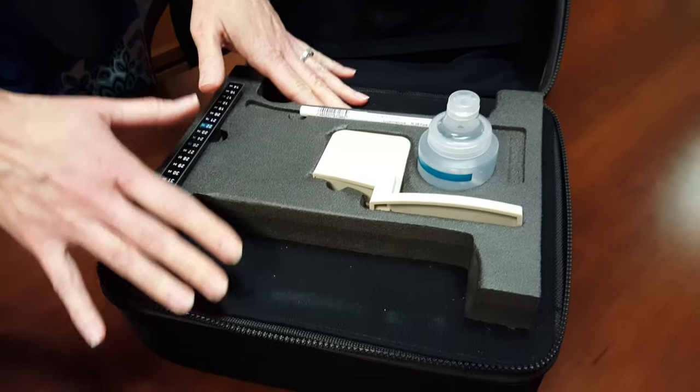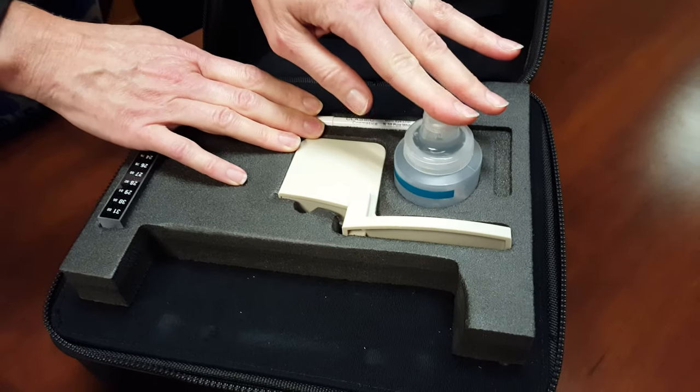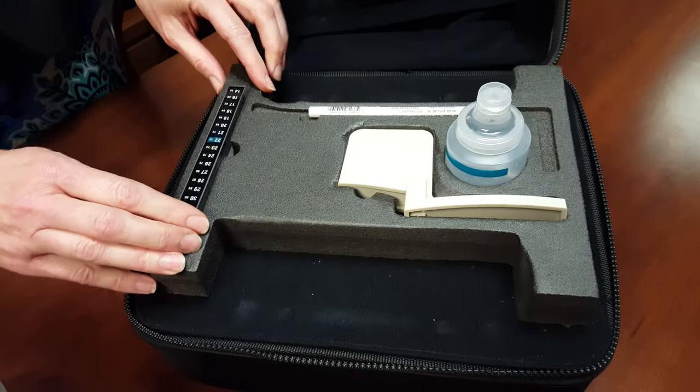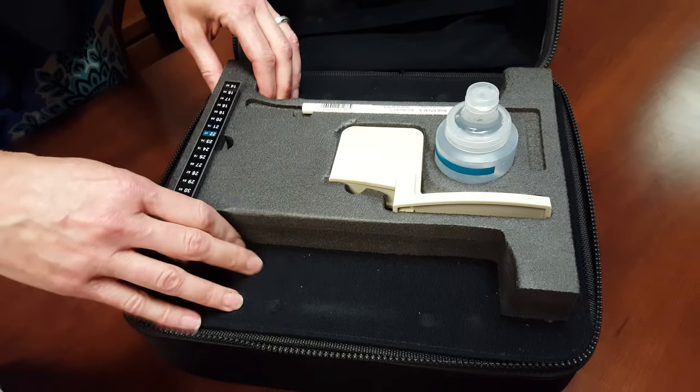There's a top layer and a bottom layer. On the top layer you will see your skin marker, your ultrasound gel, your measuring tape, and your phantom for quality verification piece. Just tuck that away in its spot.